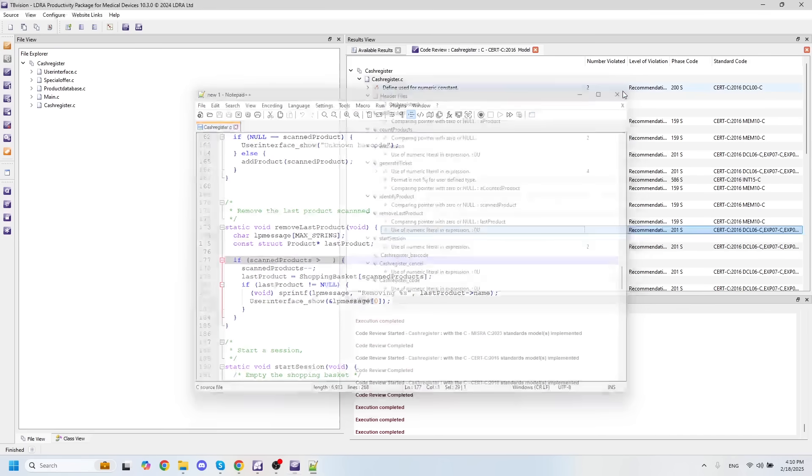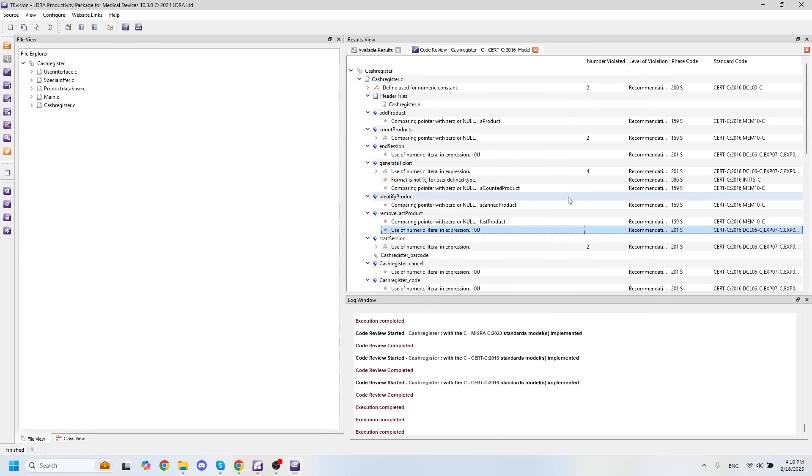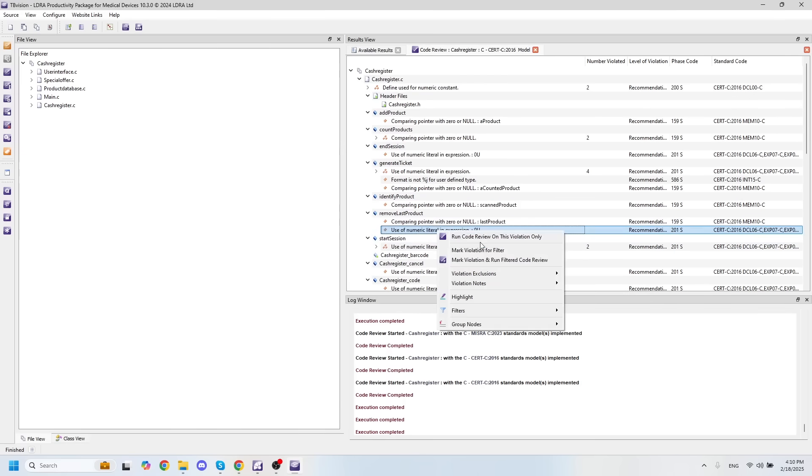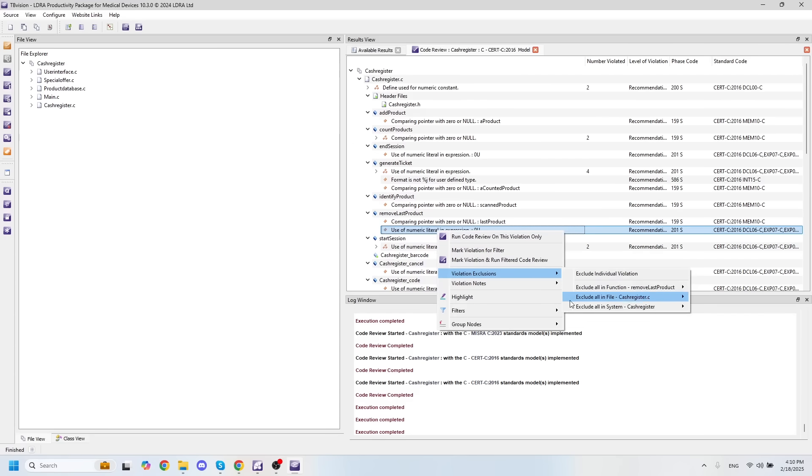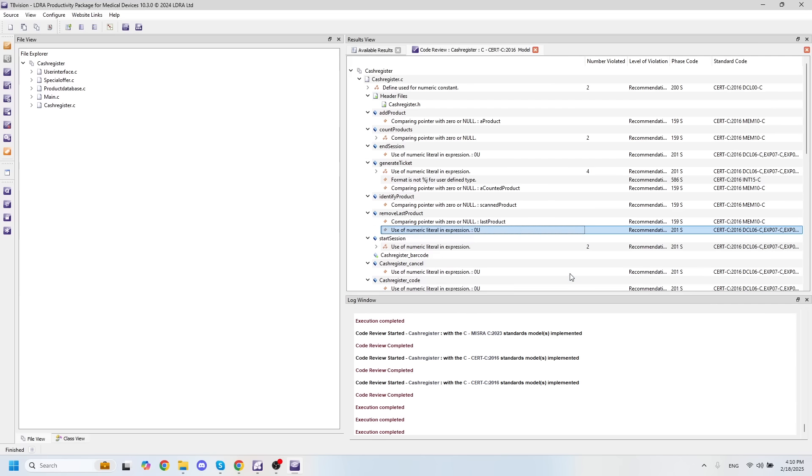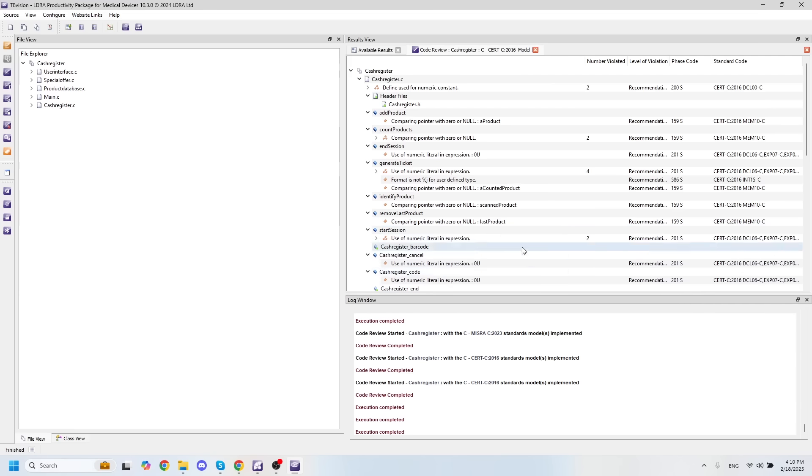If I close my Notepad++ window here, I can also exclude violations from this window simply by right clicking, going to violation exclusions, and selecting how I would like to exclude this violation. In this case, I'll just exclude the individual violation.